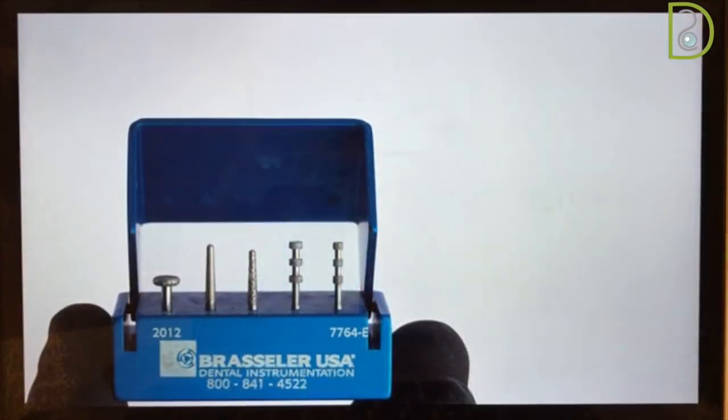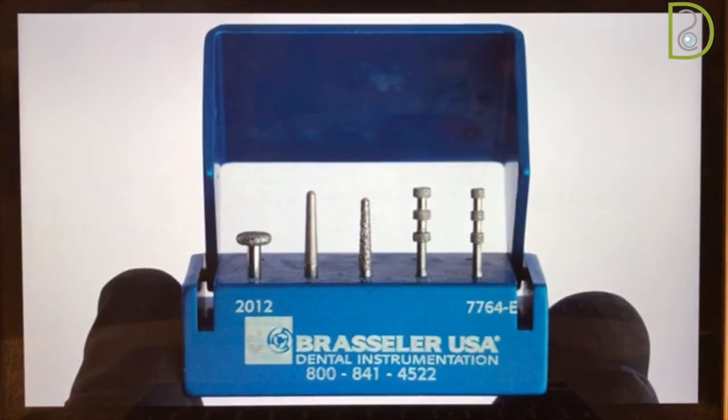Now, what if you want to freehand the preparation? Usually what we do is start our preparation on the mock-up. I'm sorry if I didn't say that earlier, but the mock-up is going to be left there and we'll start our preparation on the mock-up itself. But what if you want to start freehand?